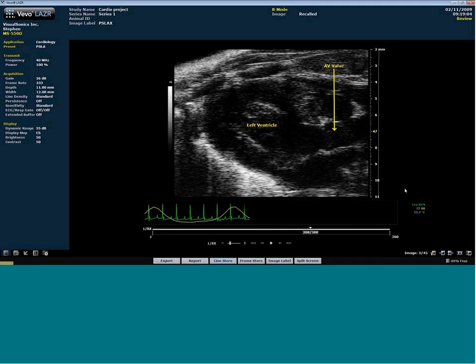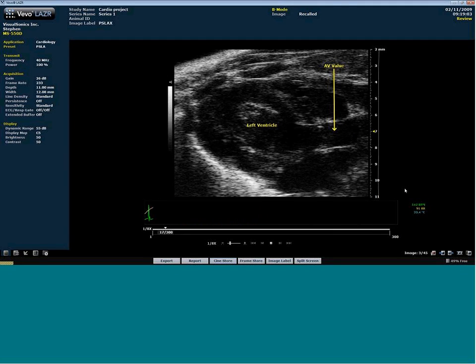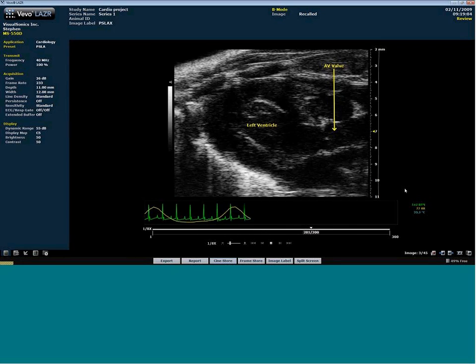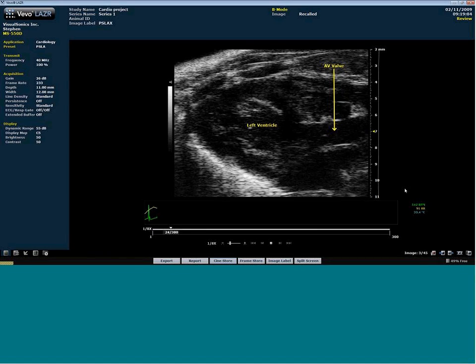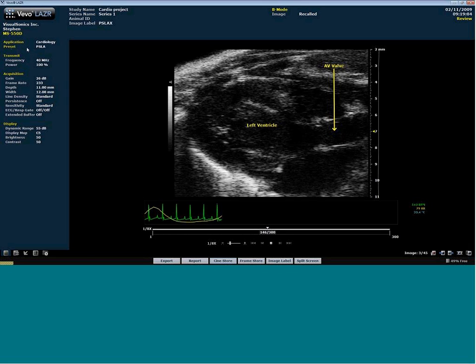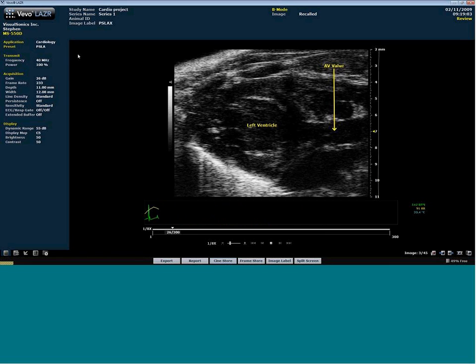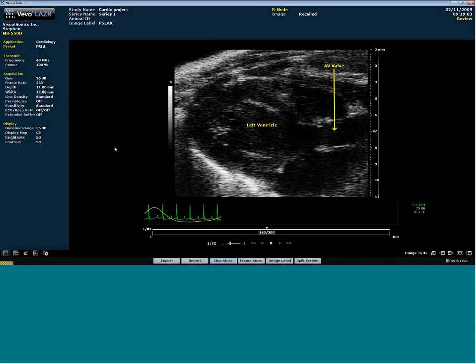The question that came in was whether or not presets are available on the 770. The most accurate answer for that is sort of. The presets are not available on the 770 in the same way that they are on the 2100, where you have a clear indication in the upper left of the screen that you have a preset, and a save preset button, where you hit it and it pops up, and you can give it a name. That's all very 2100 specific.